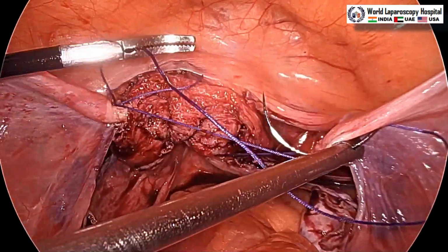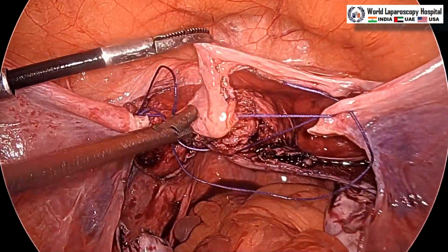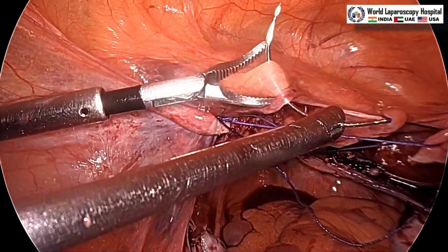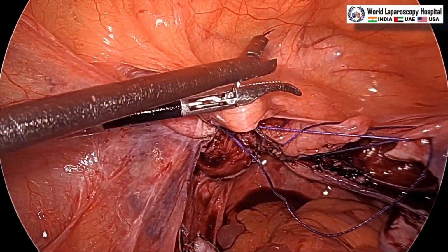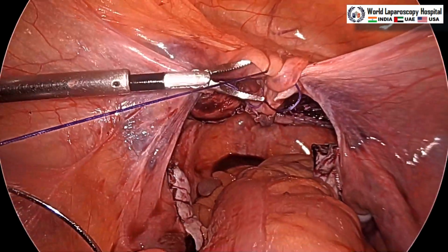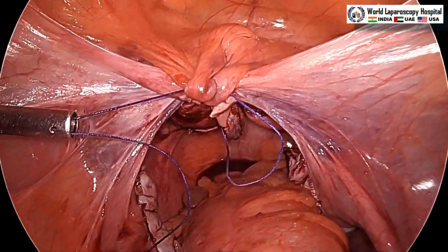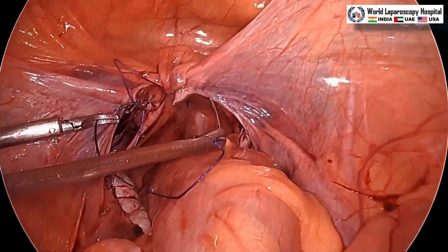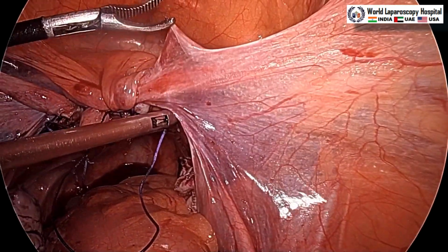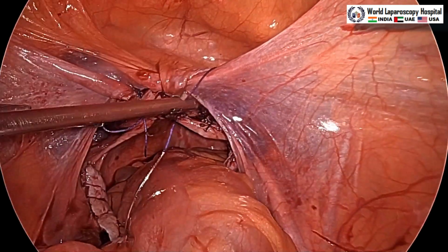Here we are using the peritoneum of the bladder to cover the vault, and both the posterior as well as the anterior peritoneum you will take. Generally, in a normal TLH we do not do that, it is not necessary, but here we will do it so that we can cover the entire stump. So, this is a sliding knot which is very beautiful, and under tension also it can pull. This is again the posterior peritoneum followed by the anterior one. Care must be taken that only peritoneum should come in the bite, and you should not accidentally prick the ureter.